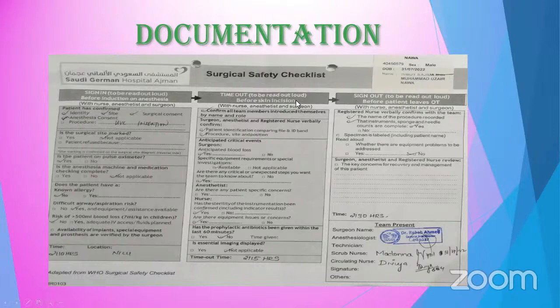Then the time out is to be read loudly by the circulating nurse. Confirm all team members introduce themselves by name and role: the surgeon, the nurse also. Then patient identification, comparing the file and ID band, procedure, site, and position. It is supine position. And then anticipated blood loss. Is the required special investigation available?